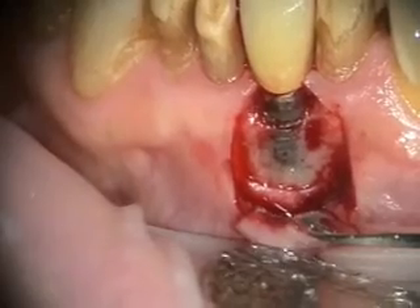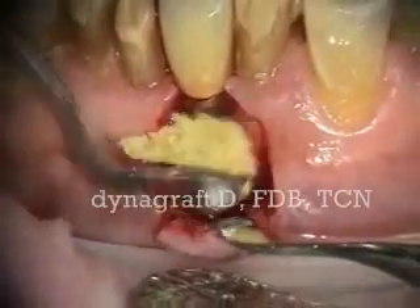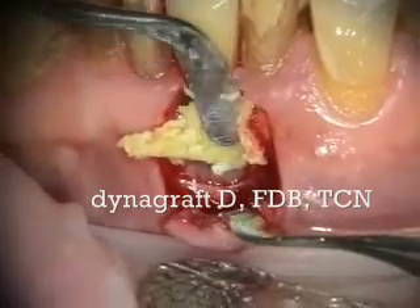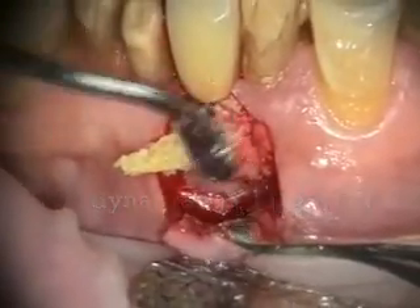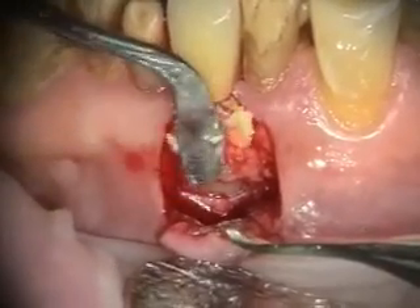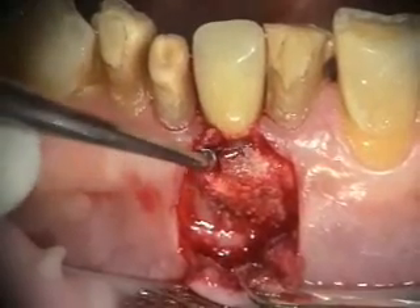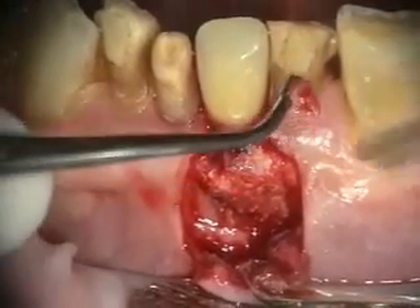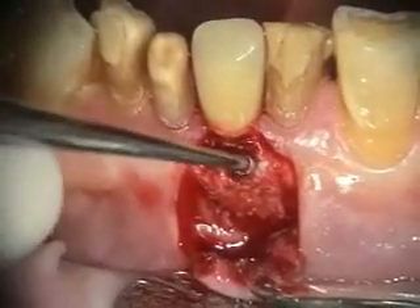I don't know if you need a probe or if you need the condenser or anything. I'm going to put the blade right there. I told him that he just had a probe.